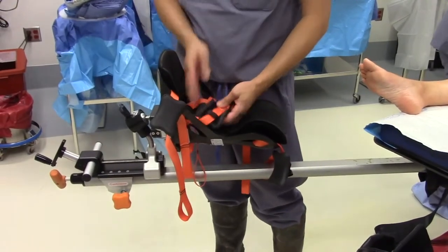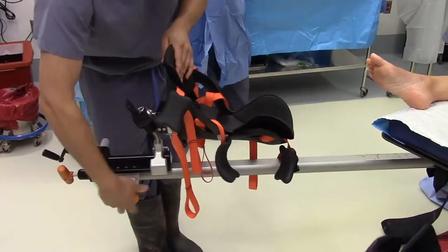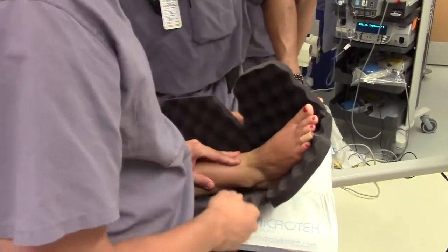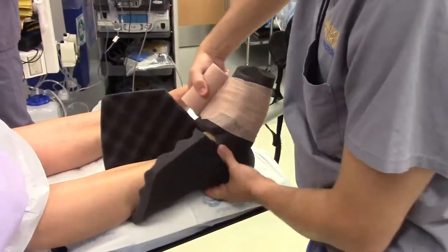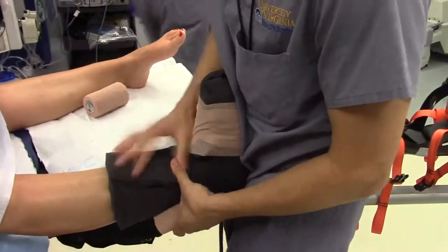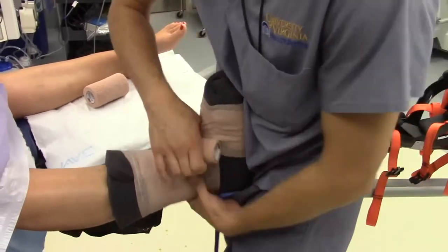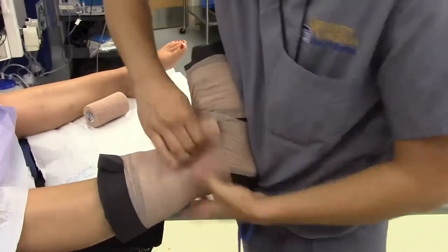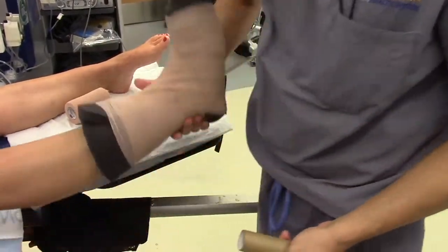This is the operative boot. The strap system is more sophisticated for better control over the foot. During surgery the foot must be very well padded. We use foam boots wrapped with co-band to ensure all pressure points are protected. When applying the co-band, wrap it fairly tight and make sure the foot is out of equinus. It's important to keep the boot well secured so you can apply traction safely.